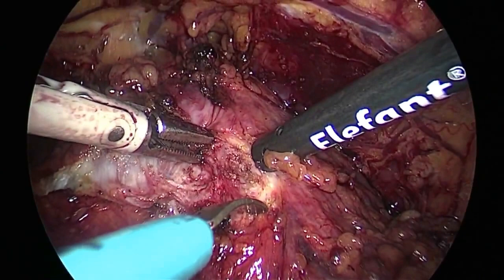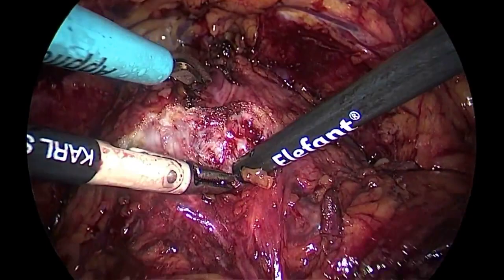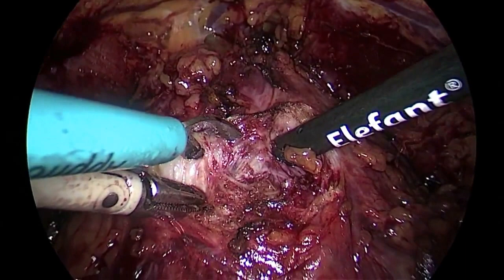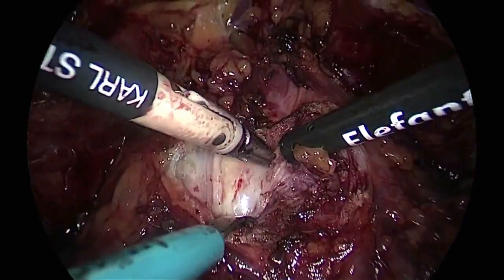Yes, usually in the past I performed a suture at this level, but I didn't record any advantages in terms of bleeding. So I think that the best technique is to coagulate step by step, slowly. And it's important to have a bipolar that is very effective. And so I think that this step is very, very important to perform.